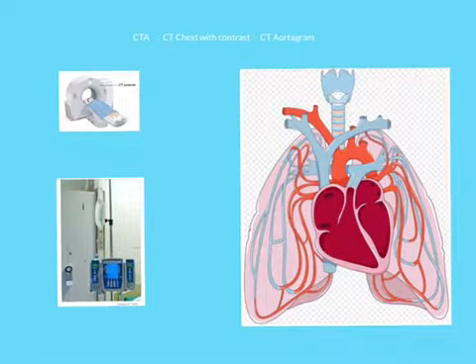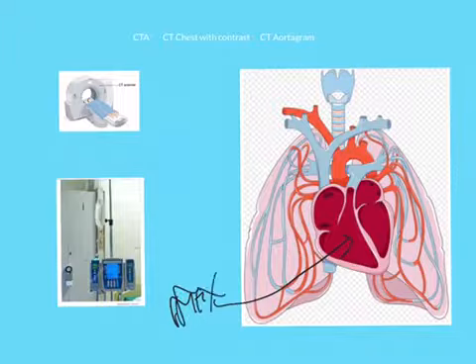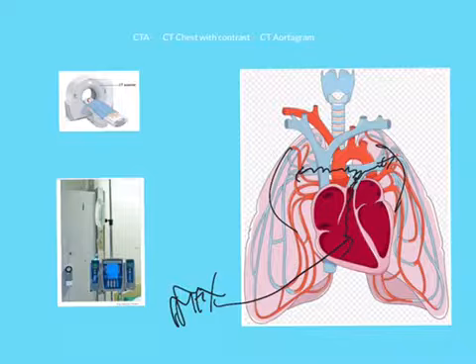So the blood that comes out of the pulmonary arteries comes out of the right ventricle, leaves the right ventricle through the pulmonary arteries, and then essentially shows the pulmonary vasculature. So the only area you're looking at first off is the blood that comes out of the pulmonary arteries, which is this area that you see right over here.